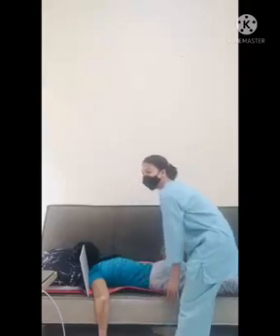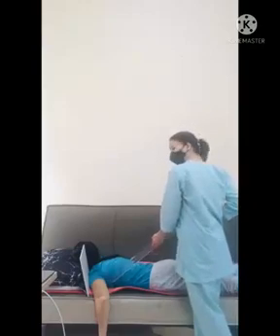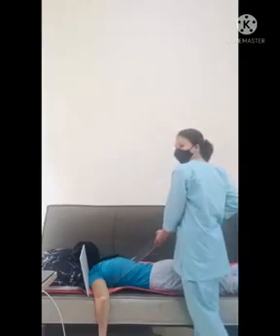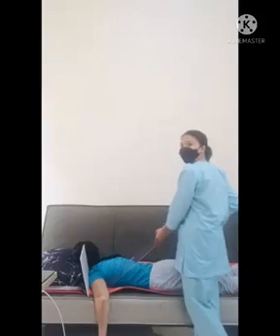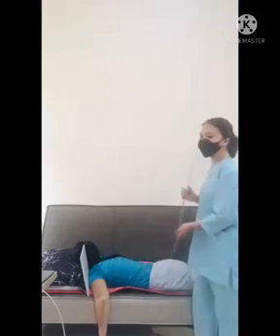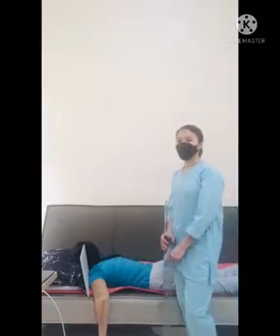The central ray in this projection is 25 degrees medially and anteriorly entering the shoulder joint, 5 inches inferior and 1.5 inches medial to the acromial edge. The structure shown is bony abnormalities of the inferior rim of the glenoid.